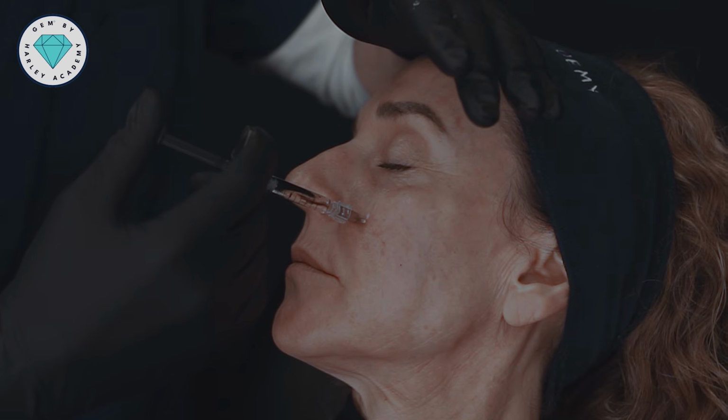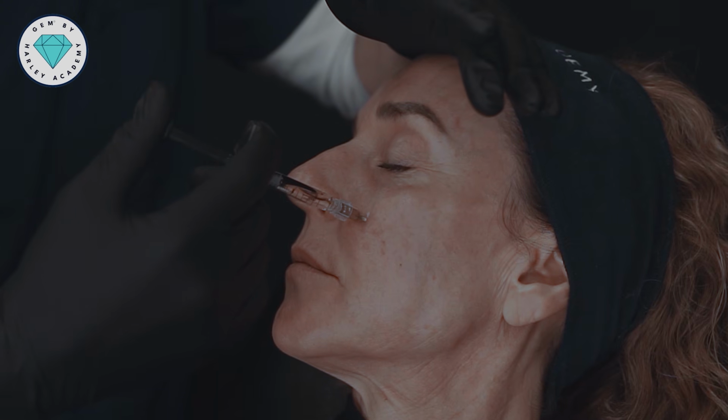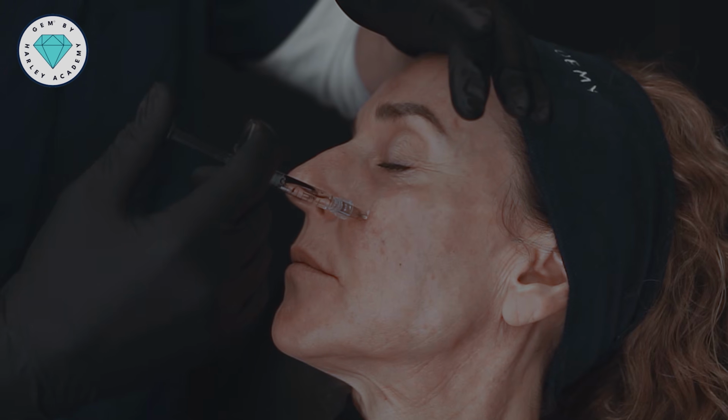If we're using a high G' product, slow injection pressure, we're minimizing the risk of filler moving along the needle track into the subcutaneous depths. I'm looking to inject 0.3 mils here.